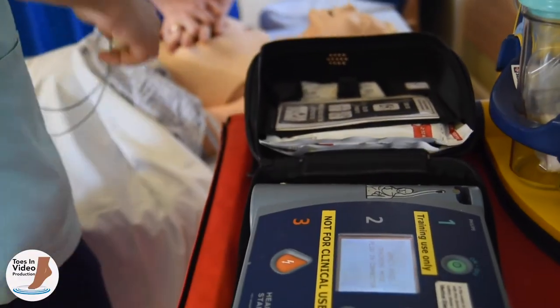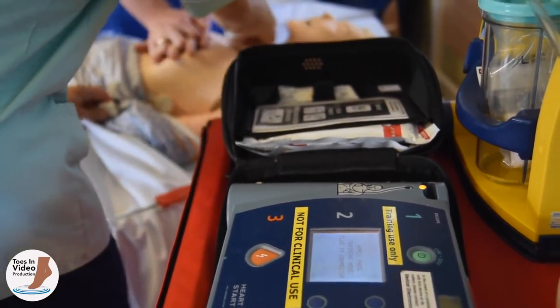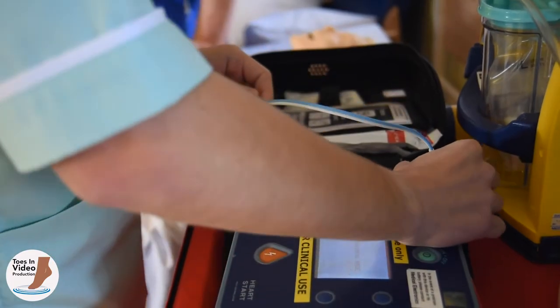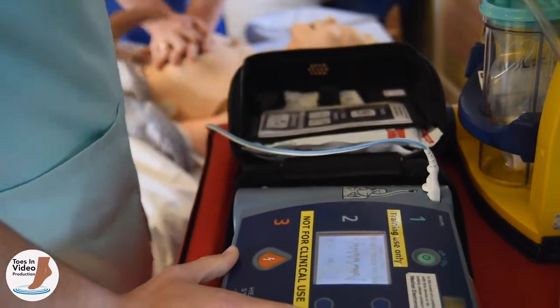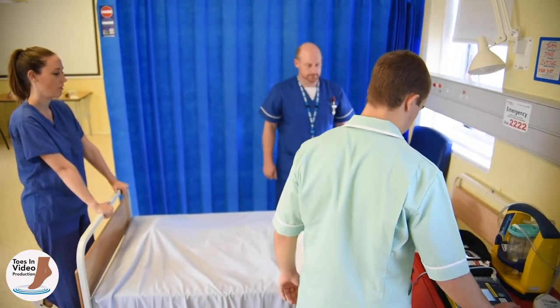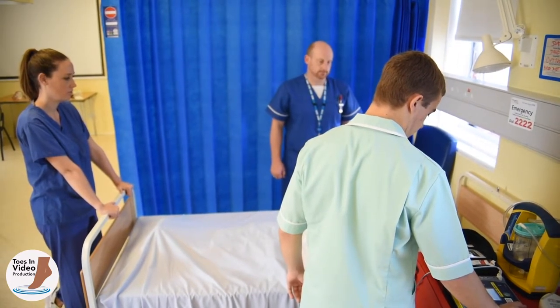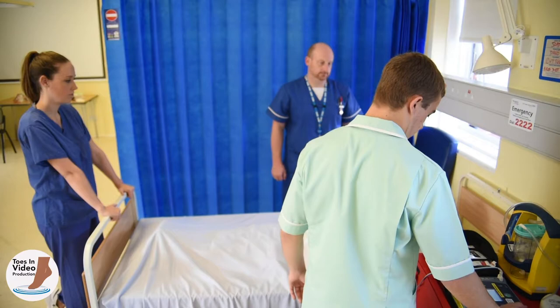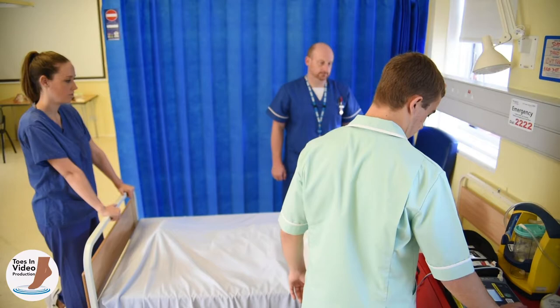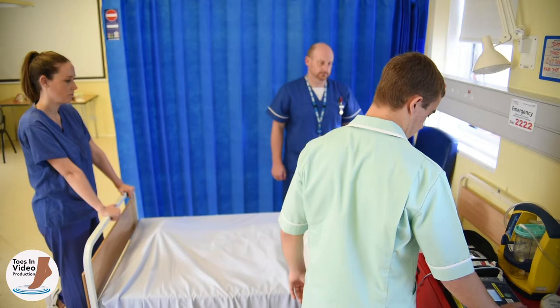Once the machine is on and the pads are attached, the AED will analyse the patient's cardiac rhythm to determine if a defibrillatory shock is required. During this analysis it is important that no one touches the patient — if the machine detects movement artefact it will stop analysing and need to begin again, delaying a shock and further CPR, which will adversely affect the patient's chances of survival. If a shock is required, the machine will issue a verbal prompt that it is charging.